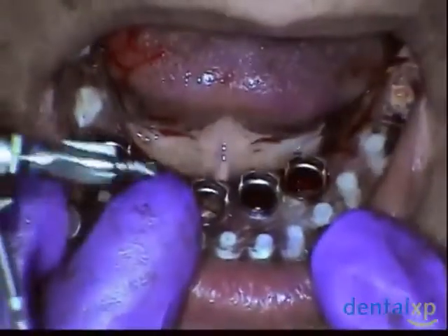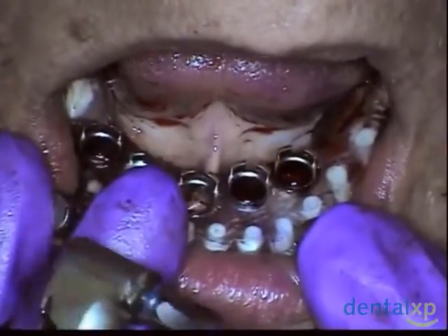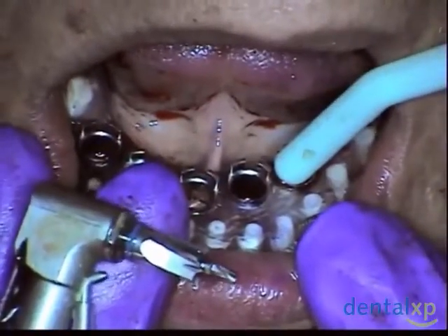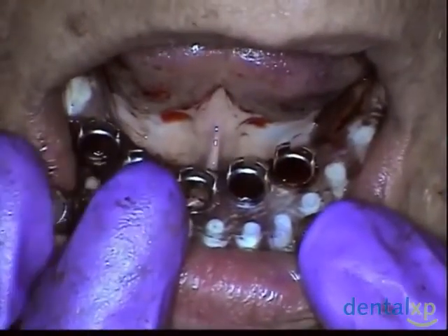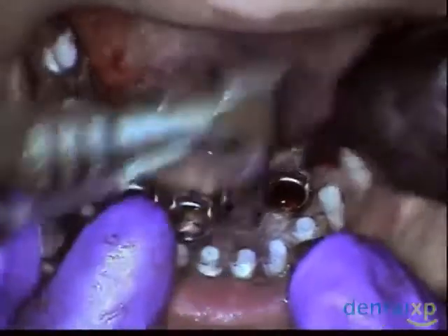I think you can see with the ILS system, this is the countersink that has the stop on it that'll let me go into that bony interface and flatten it exactly where I want to be, and that was predetermined into the treatment plan, which makes it a little easier and a little more efficient to get where we want to go.